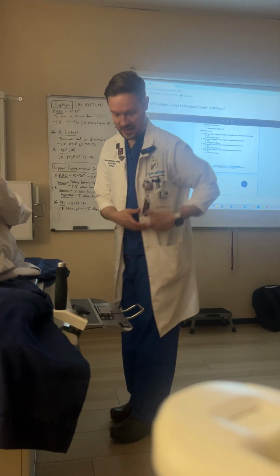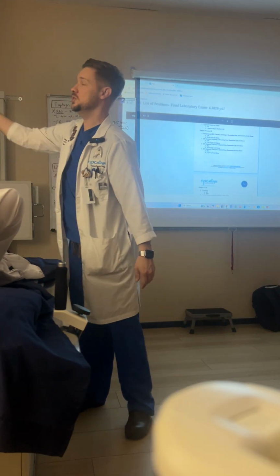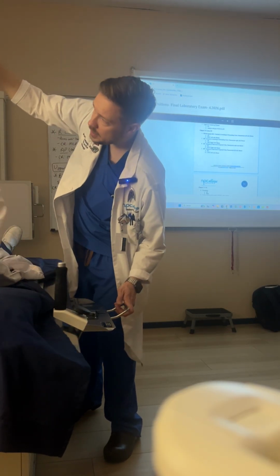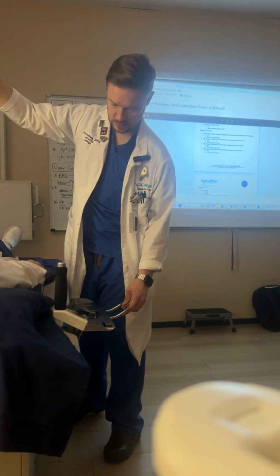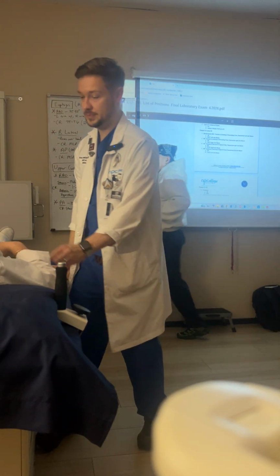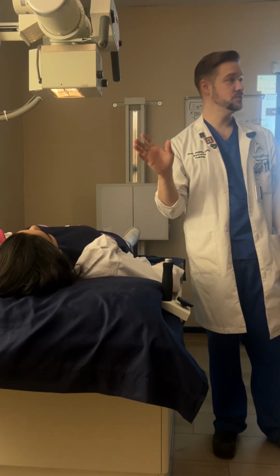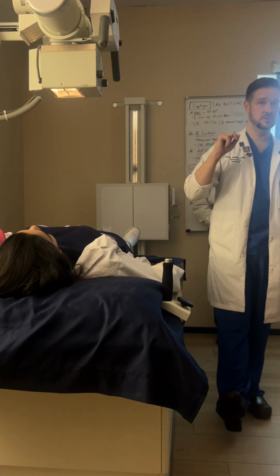All right, so let me have you lie flat on your back. And which one are you doing first? Just for demonstration purposes, I'm going to show you the small bowel follow-through images. They're very, very simple. So for the first one, 2 inches above, and she should be PA, but this is just for demonstration purposes here, okay? So if she was PA, 2 inches above for that initial image.